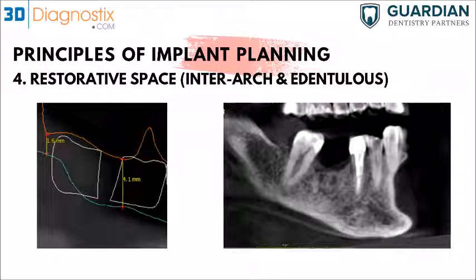Or we can actually know that we have a problem, and then we can have the solution for that problem: either crowning the opposing or opening the bite. So that helps with the planning part. And this is why I always recommend sending the bite and the opposing.